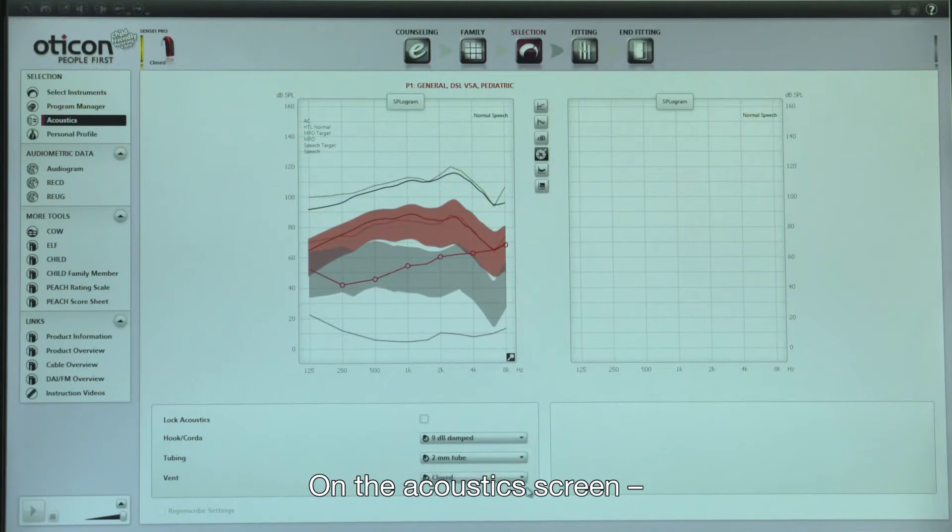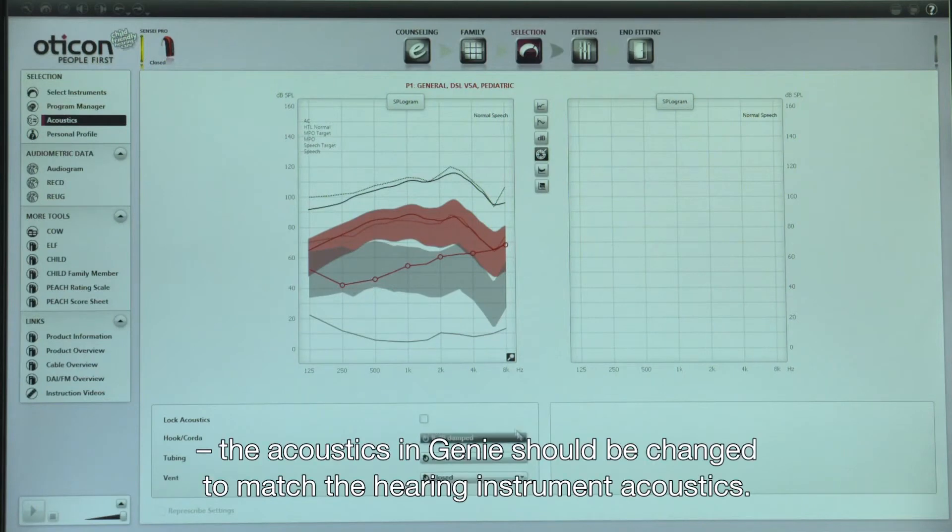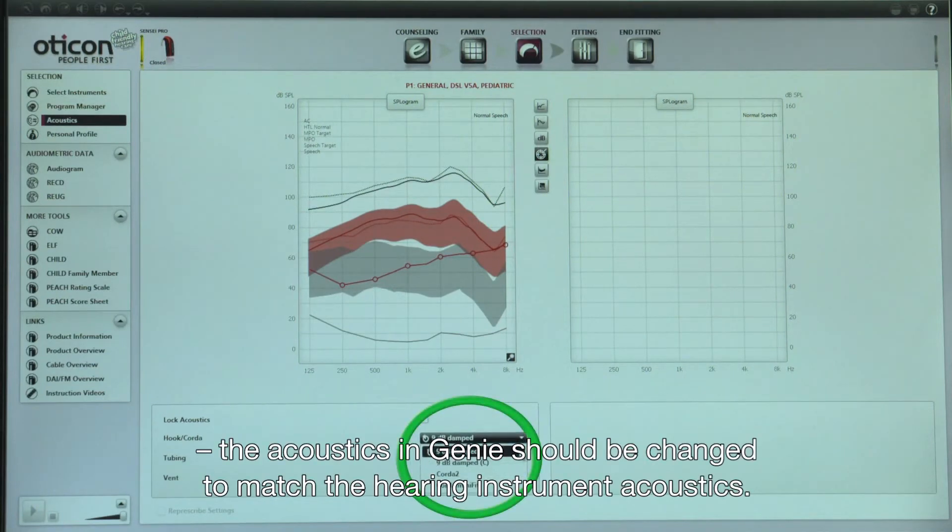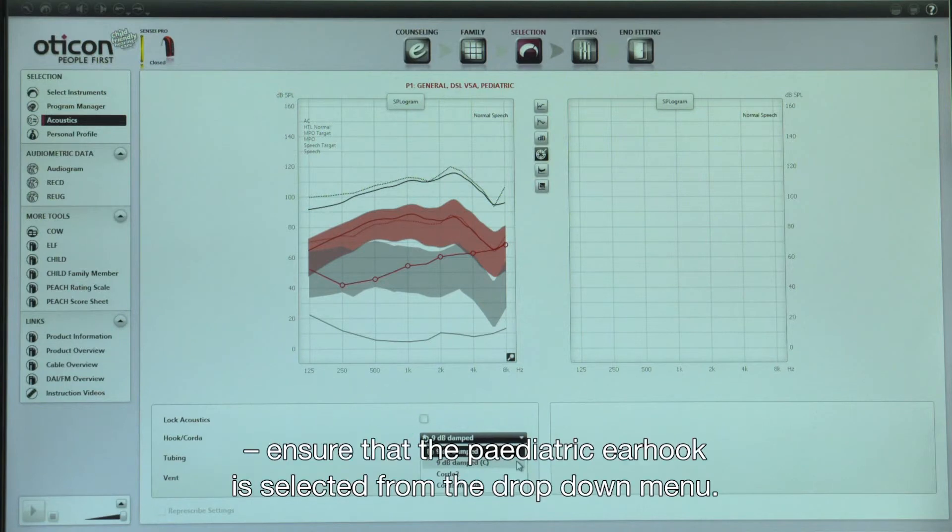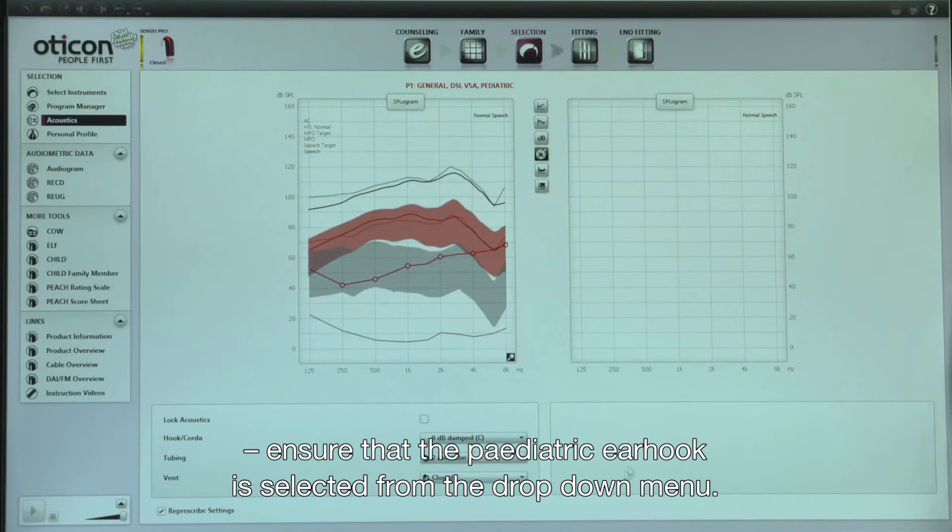On the acoustics screen, the acoustics in Gini should be changed to match the hearing instrument acoustics. For example, if using a pediatric ear hook, ensure that the pediatric ear hook is selected from the drop-down menu.